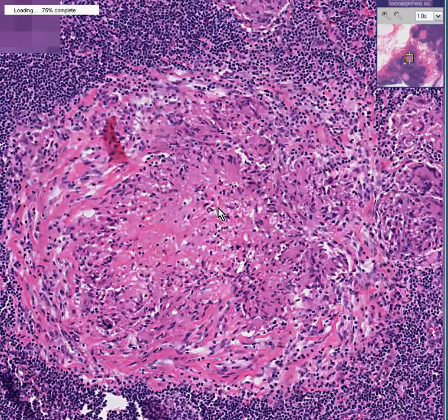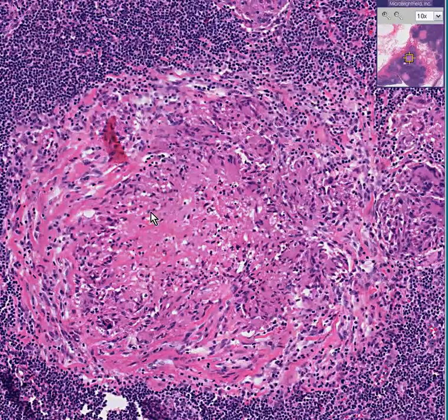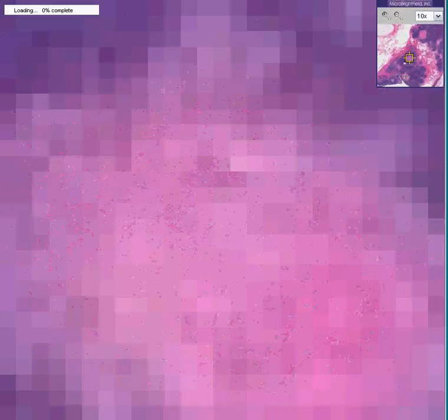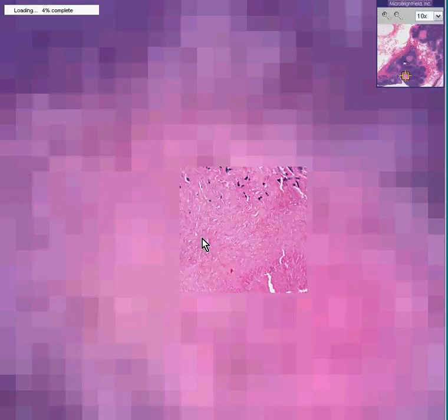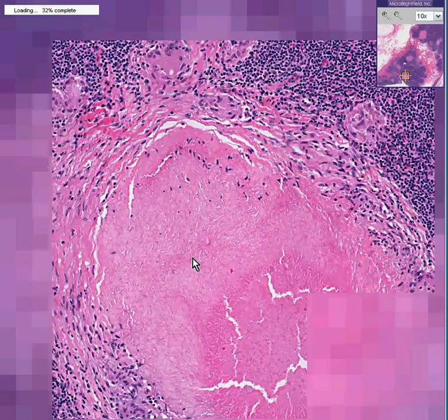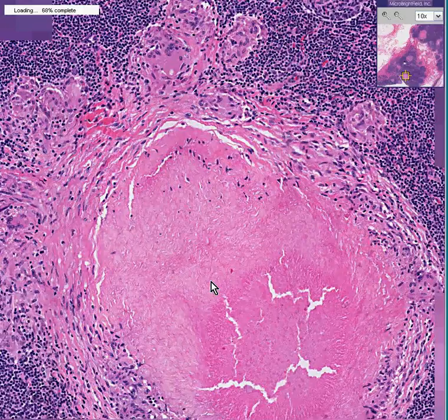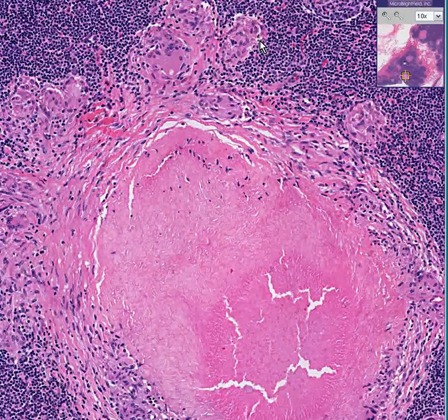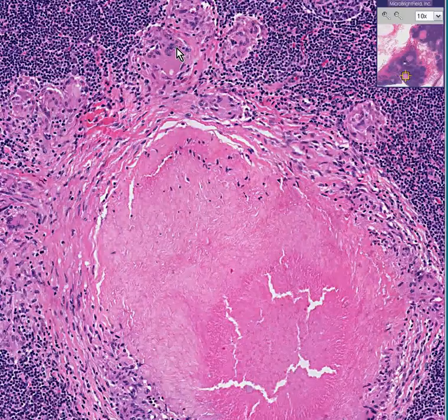In this smaller granuloma, I might have a hard time convincing you that this was necrosis in the center. But if you go to the larger granulomas, you can see clearly this is a necrotizing, or centrally necrotic, or caseating center inside of this granuloma, which is surrounded by fibroblasts, histiocytes, lymphocytes, and many classical multinucleated giant cells.